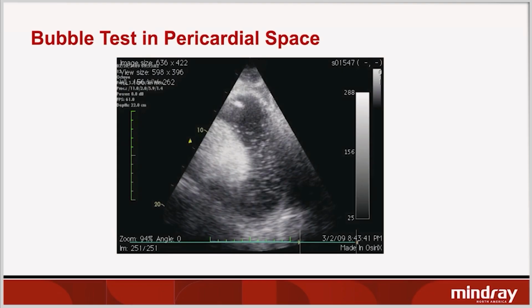In this case, just draw back some fluid because they're in cardiac arrest. You don't have to draw much out to solve the problem, tamponade, because the last few drops are the thing that cause tamponade.